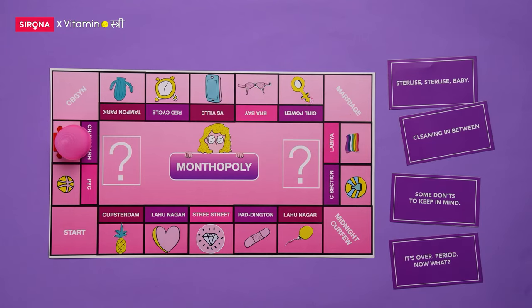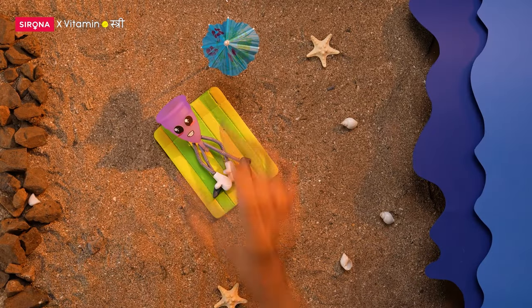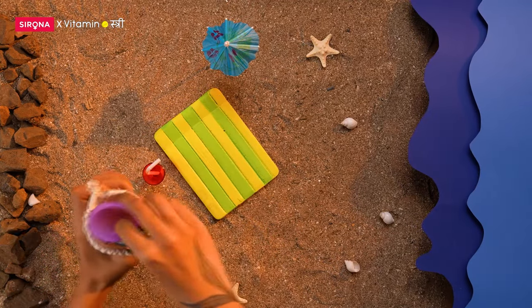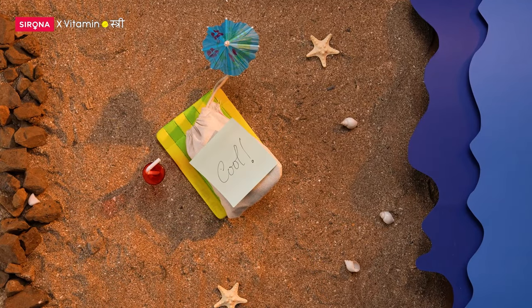It's over. Period. Now what? Repeat sterilization. Then let your cup sunbathe or wipe it dry with a soft napkin. Once moisture free, store it in a cool, dry place in a breathable pouch until your next cycle.